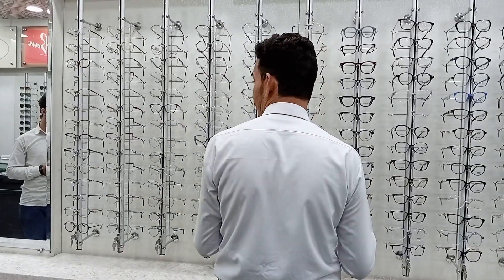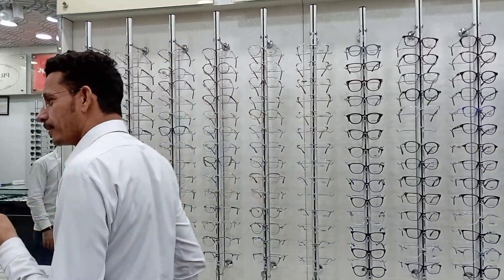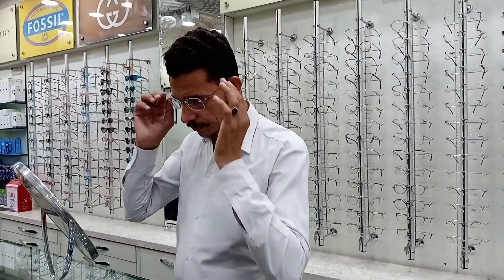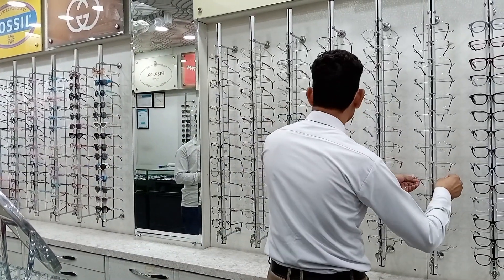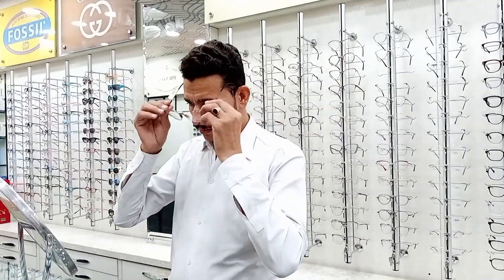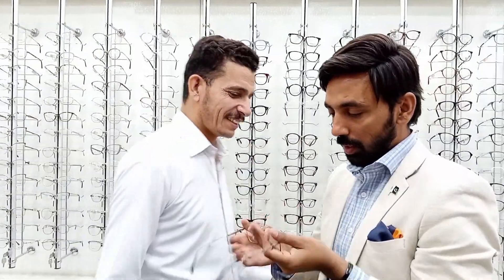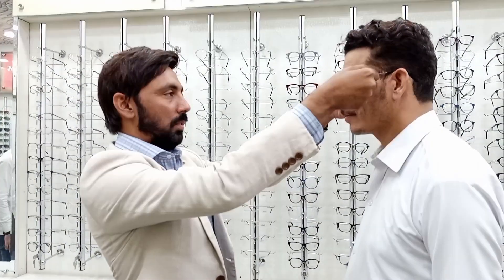This video is about bifocals. You have to let the patient choose his or her frame according to their face, and you will help them according to their nose, their anatomy. The frame should be bigger in size. Once our patient has selected their frame, let's adjust the frame first — your frame should be well aligned on the patient's face.